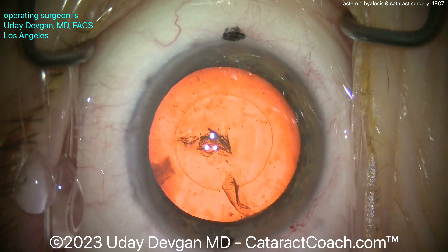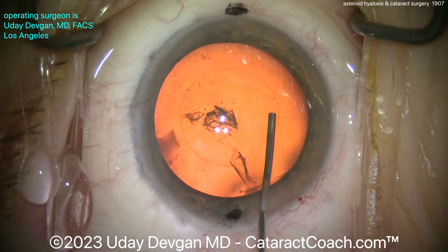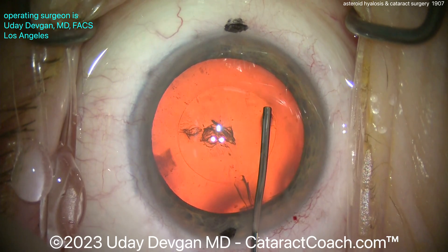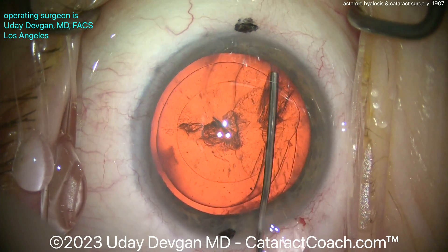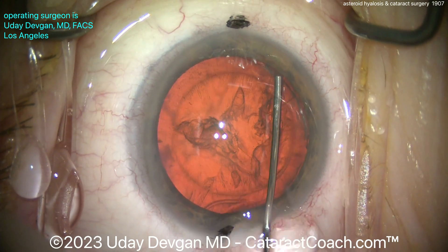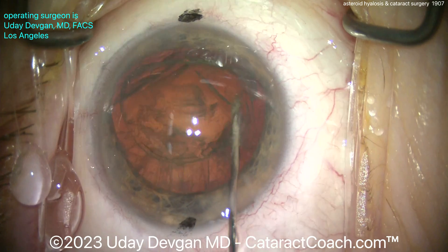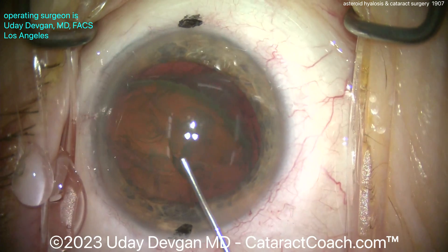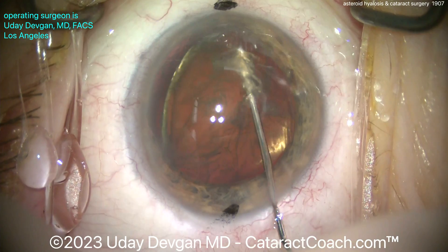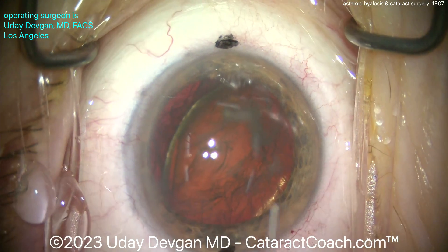The cataract part is going to be very routine. The question is: what kind of lens can you put in this patient? The general consensus is to avoid a silicone lens, because sometimes there can be interaction between the asteroid hyalosis materials and the silicone lens, and that may cause issues. So we'll put in a hydrophobic acrylic lens.